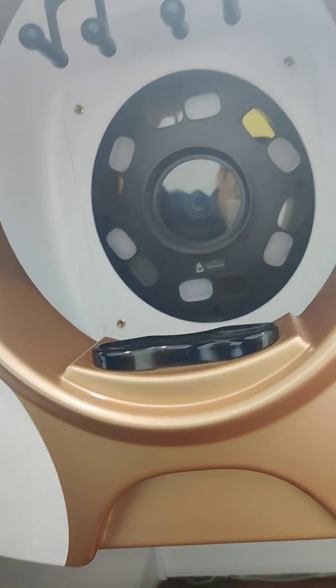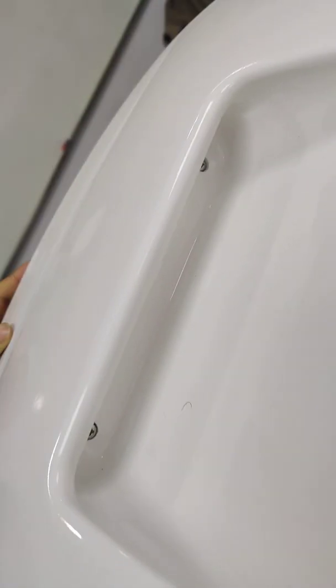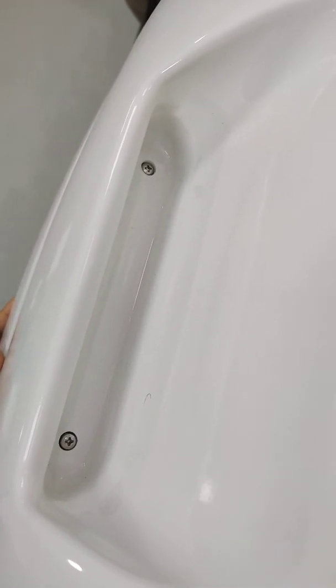We need to dismantle the shell. On the downside there are 3 screws. 1, 2, 3. We need to take off the 3 screws. On the upside, right here, there are also 2 screws. We need to take off them.